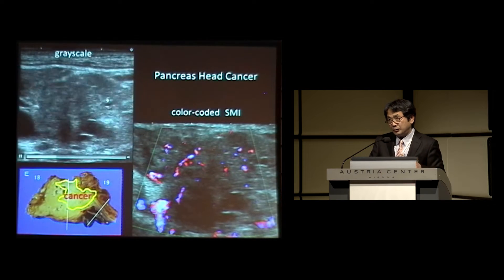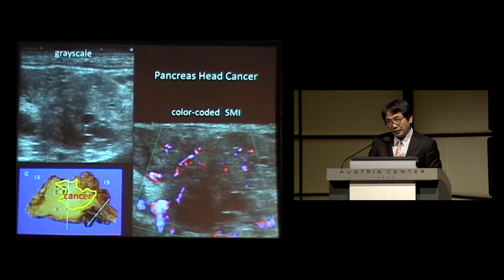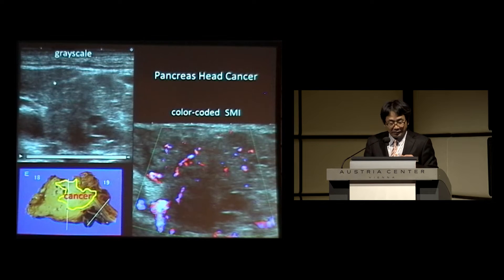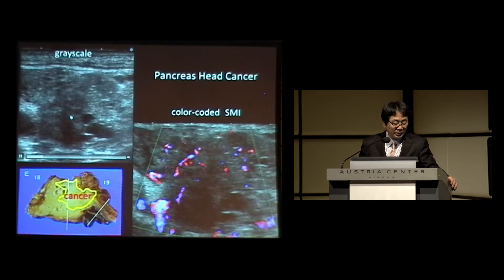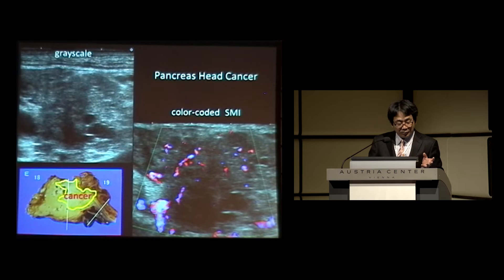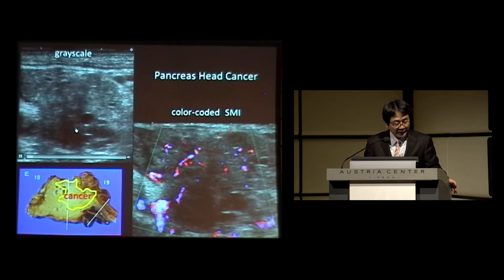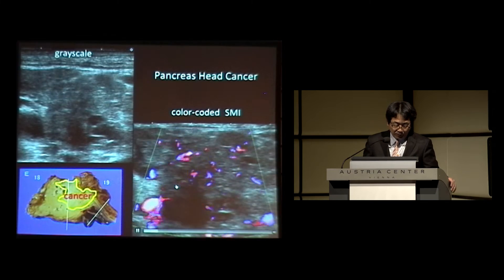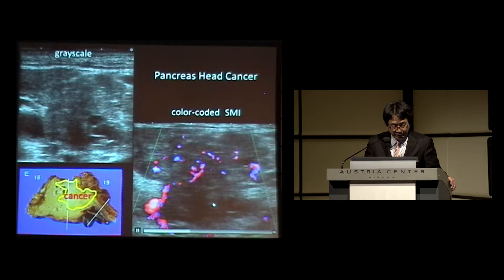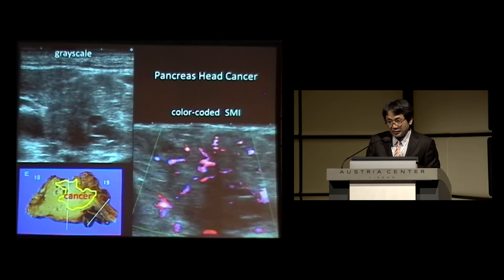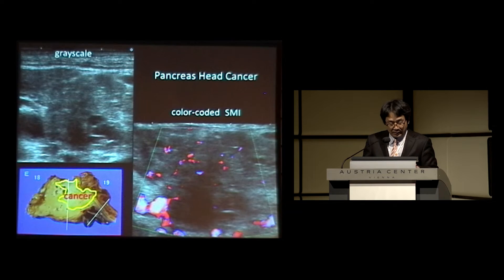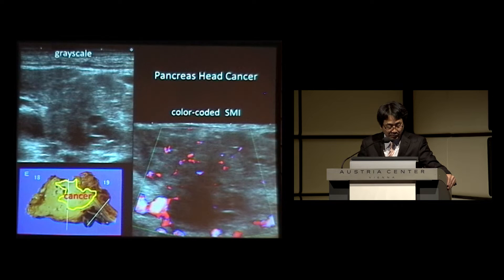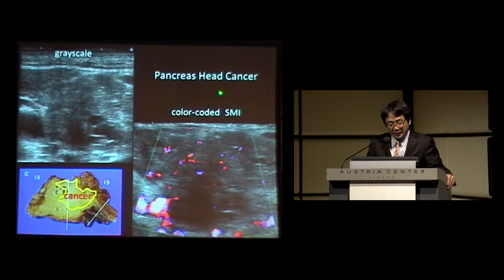SMI can also be used the other way around to detect or diagnose tumors. This is a case of pancreatic cancer. On grayscale, you cannot be really sure about the diagnosis or even the presence of the tumor — you could only say this area is a little hypoechoic. Color-coded SMI revealed that this area is quite hypovascular, which is the nature of pancreatic cancer, strongly suggesting the diagnosis. We confirmed it by fine needle aspiration and surgical operation.